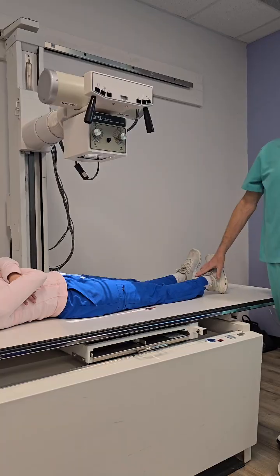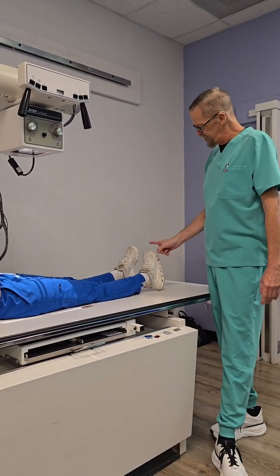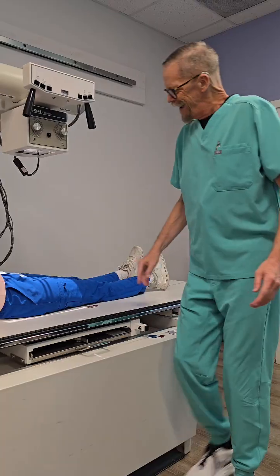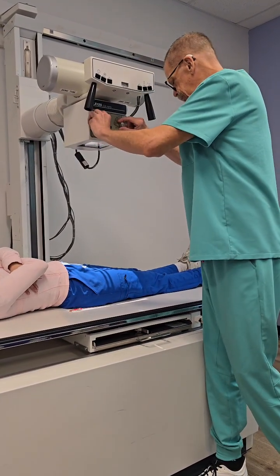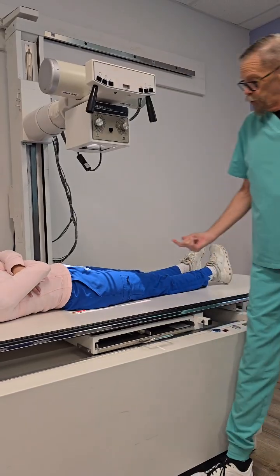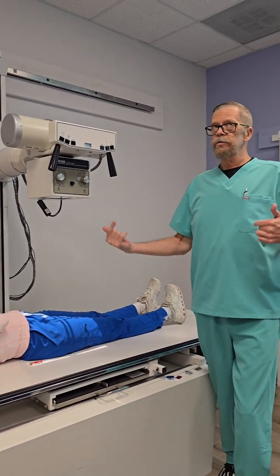Don't worry about how the foot looks. Every quiz we've had is what direction are the toes pointing — oh, they're pointing that way a little bit. The marker out here, and that pretty much is your AP proximal femur.